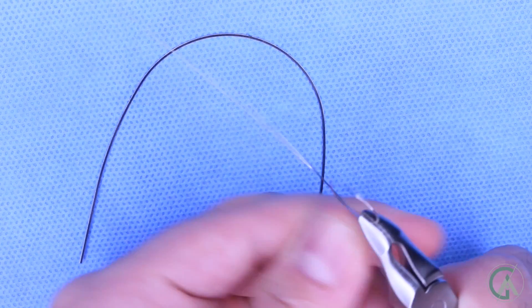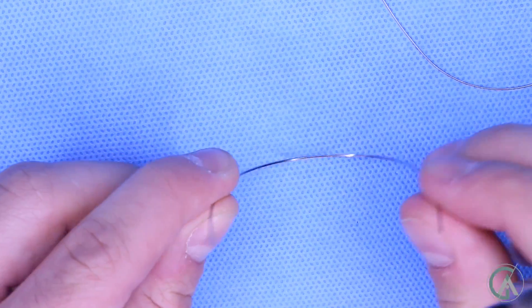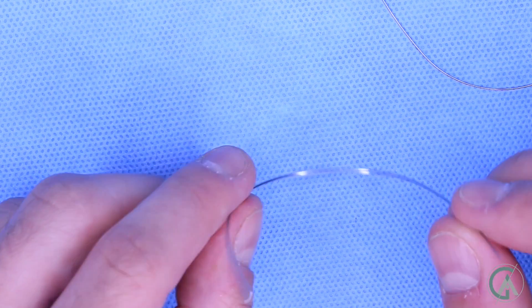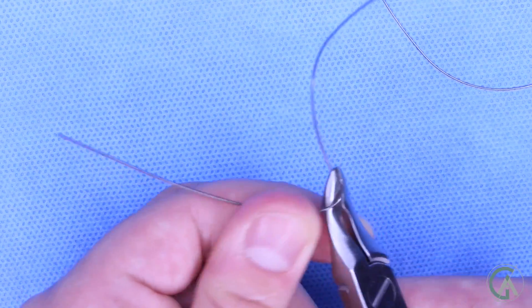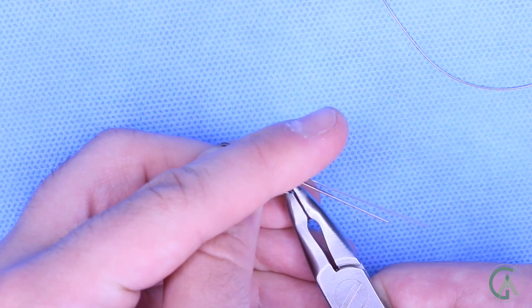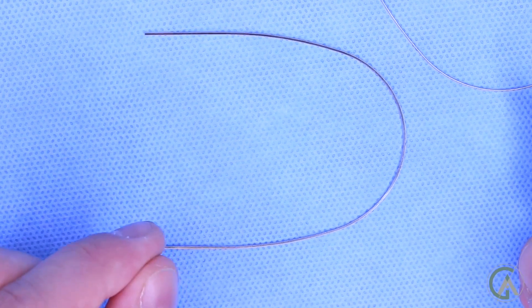So you try to bend it, and it springs right back. Over here we have a rectangular nickel titanium wire, and when you look straight down it, it has a rectangular shape. Same with this wire — it's a little bit darker because it's more rigid. And when you try to bend it, it will fling right back to its original shape. Again it bends back to its original shape, and that allows for us to help align your teeth.